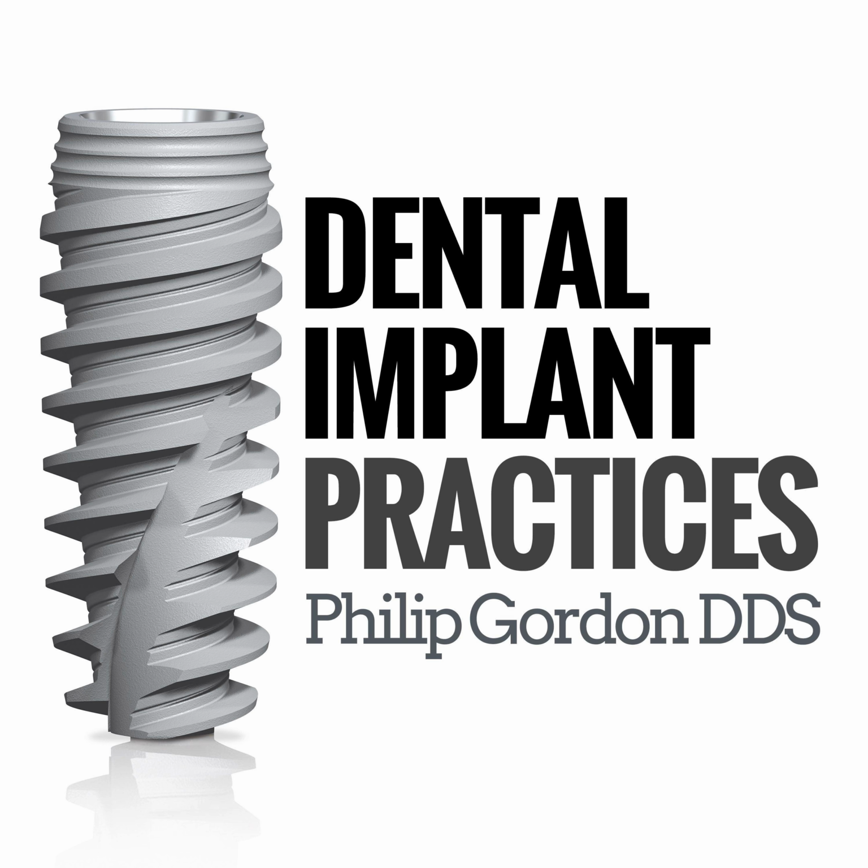So they make custom healing abutments, different companies. There are temporary abutments that they all make, so you can make more of a custom healing abutment on top of that, or on the temporary abutments, you can make a temporary tooth, whether it be the anterior zone or the posterior zone. With all these implants, there are also impression components that go with that.